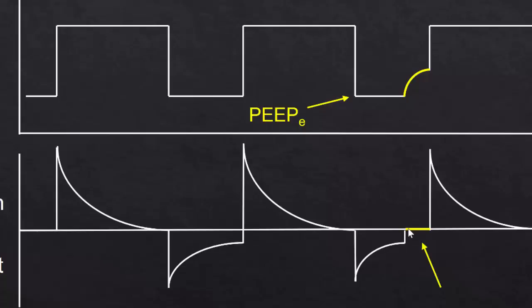I talked about that in my first talk, but the pressure at both ends of a system are exactly the same when there's no flow. So the mouth and the alveolar pressure is exactly the same when there's no flow. Well, that means that the amount of intrinsic PEEP was approximately the same as the amount of extrinsic PEEP, but we couldn't have recognized this easily from the ventilator screen.